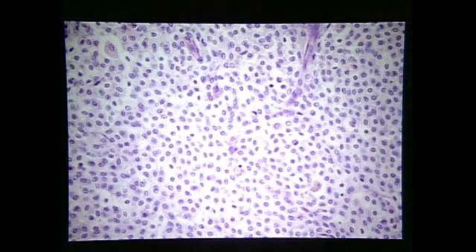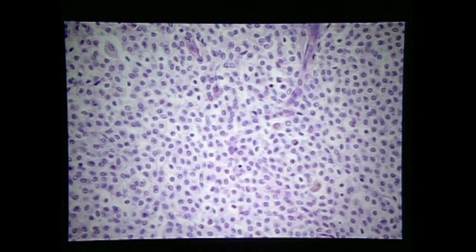A case, and the only one, of cutaneous mast cell tumor affected the skin over the metacarpus. At the gross level, the tumor revealed itself by this greenish discoloration, and microscopically it was composed of a monotonous set of round cells that, when subjected to Giemsa stain or toluidine blue, showed evidence of metachromasia. Also, as a hallmark, a couple of eosinophils can be appreciated interspersed with the cutaneous mast cell tumor.